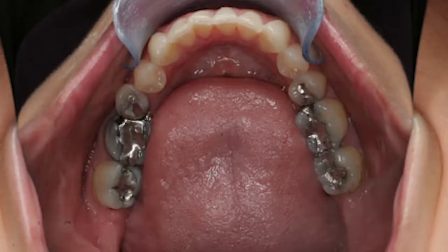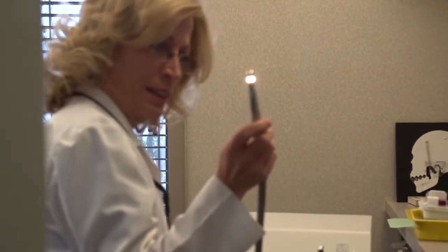Unfortunately, most adults have wall-to-wall silver fillings already, and they've already been mutilated by big rotary instruments. If you use the drill, the drill will cut anything in its way. If the patient moves, the drill is going to cut away a little bit of enamel that you didn't plan on. The first time you touch a tooth with a high-speed drill, you can doom that tooth to a lifetime of care.